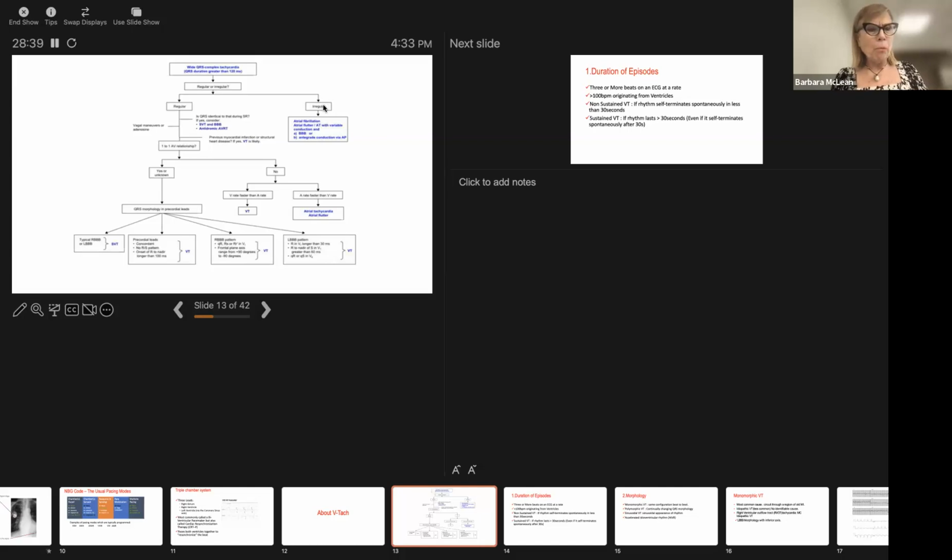Okay, that's really important. Now, I'm not saying anything because they cardioverted him, so fantastic. But actually, from his first EKG that I saw, I didn't see the EMS EKG, I only saw the first EKG, which I showed you. What I felt was that it was irregular, and that did not look like VT to me. Yes, he may have poor pulses because he's firing quite rapidly, and he doesn't have optimized filling because his pacemaker isn't working.